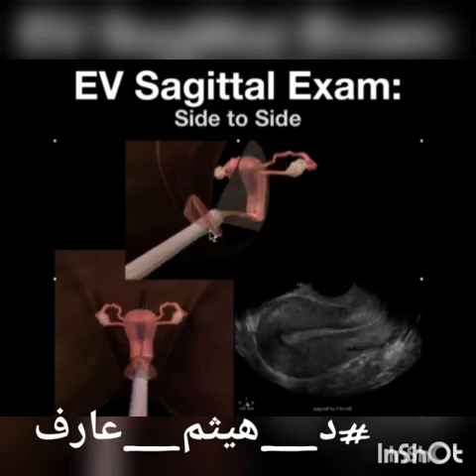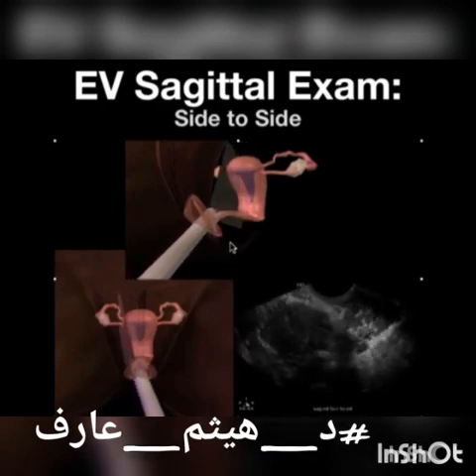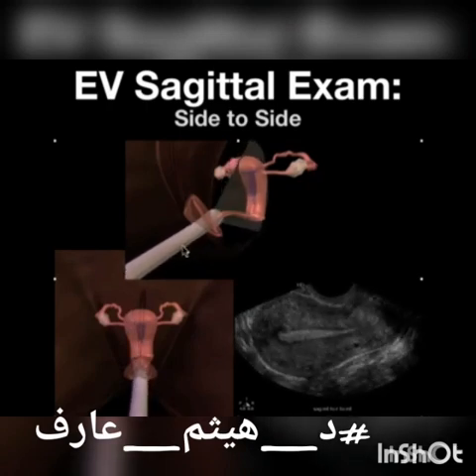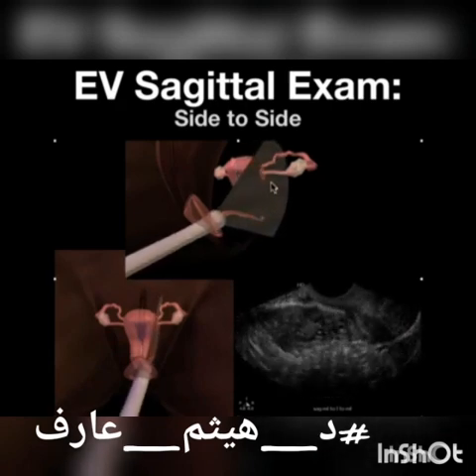In the sagittal plane, by bringing the transducer towards the patient's left thigh, you're going to visualize the right side of the uterus. By bringing the transducer towards the patient's right thigh, you're going to visualize the left side of the uterus. But it's important, just like on the transabdominal, that you scan the entire uterus.